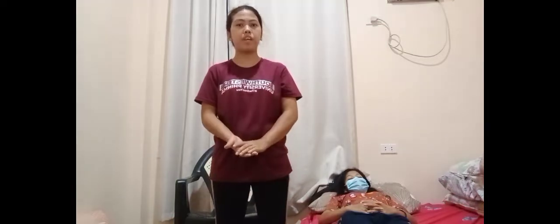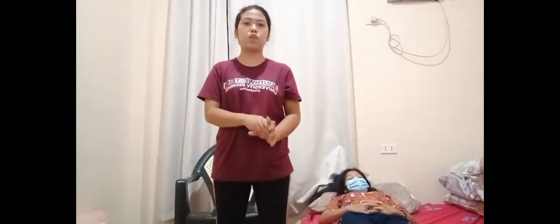Today I'm going to demonstrate how to transfer a patient from bed to chair and from chair to bed. Transferring a patient from bed to a wheelchair or a chair increases mobility status, prevents complications of immobility, increases independence and promotes self-esteem. A transfer or gait belt is used to maintain control and for additional support.